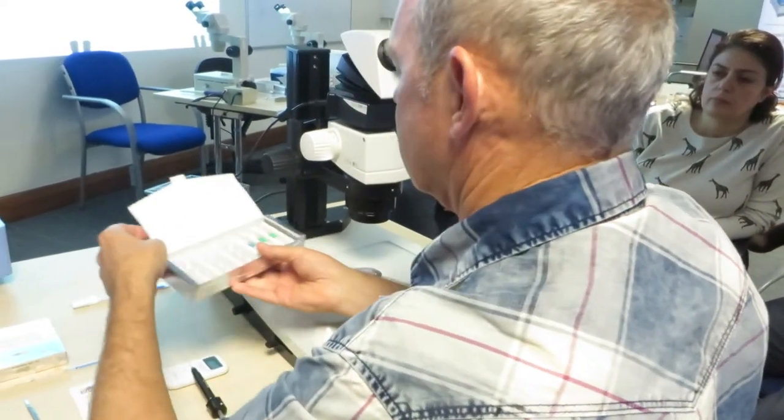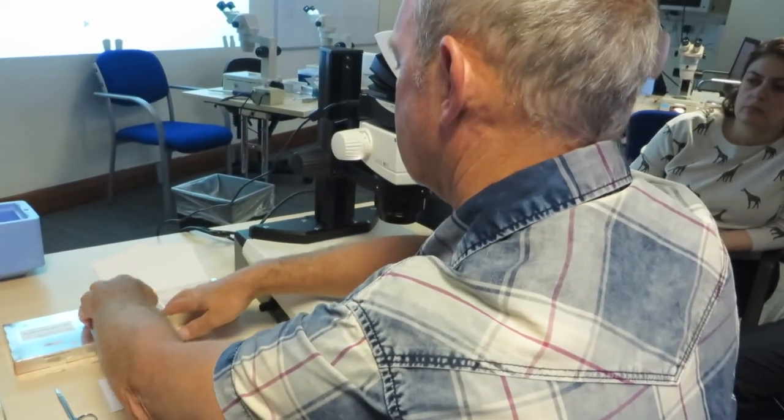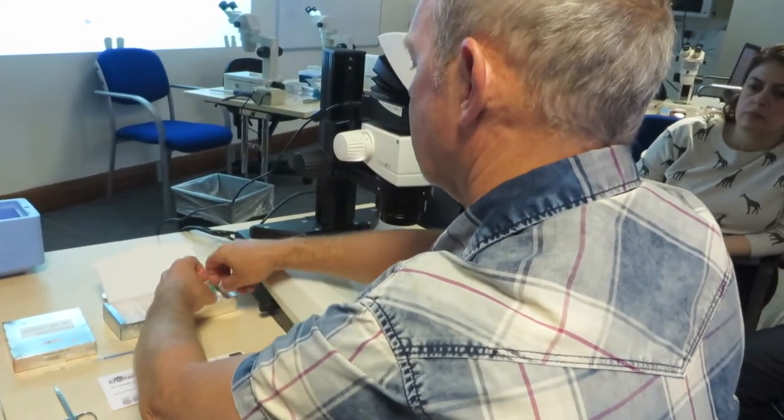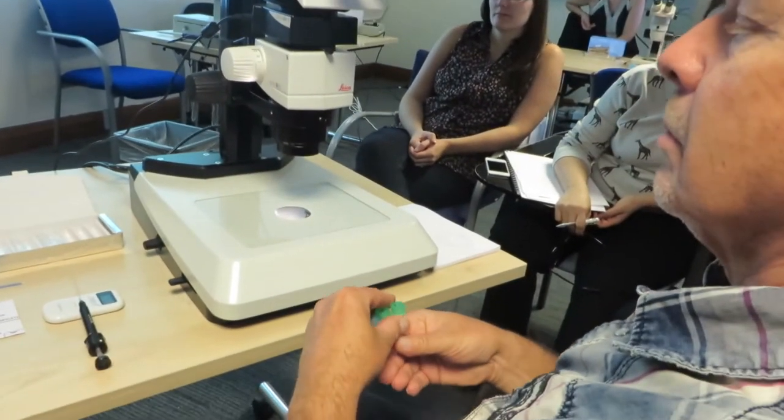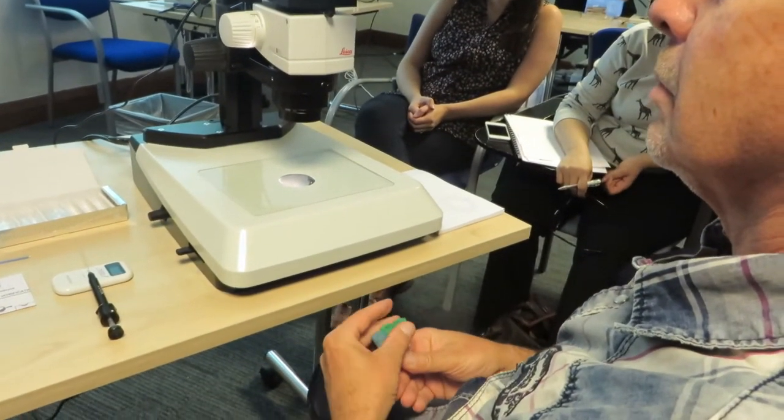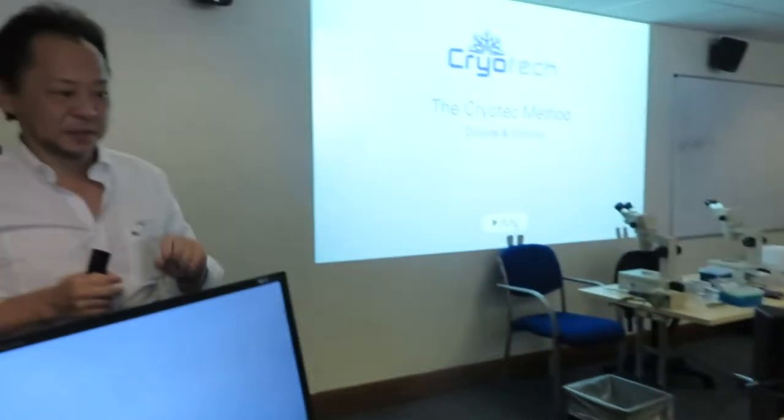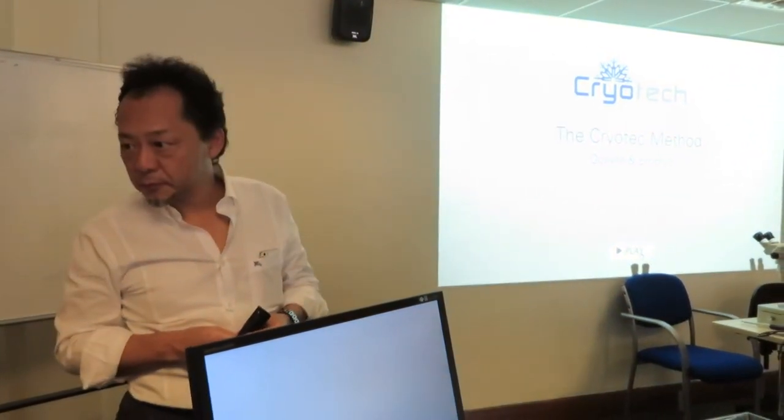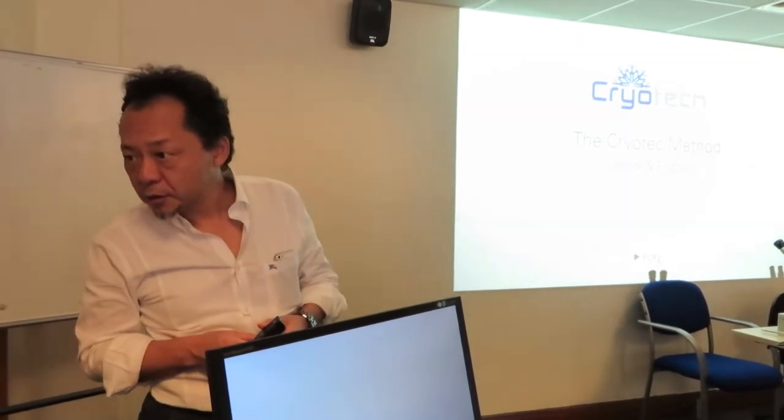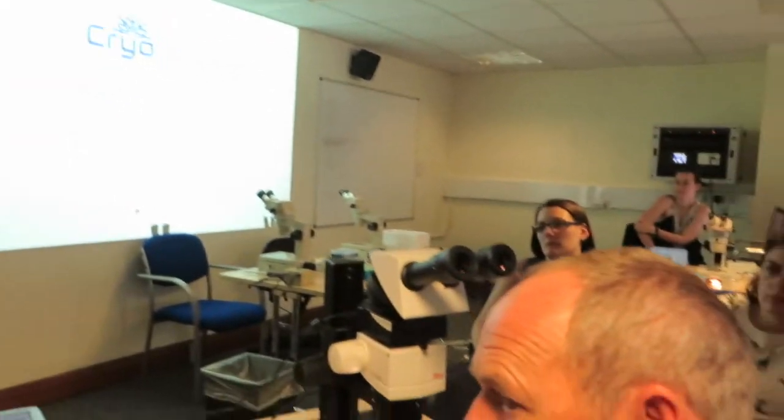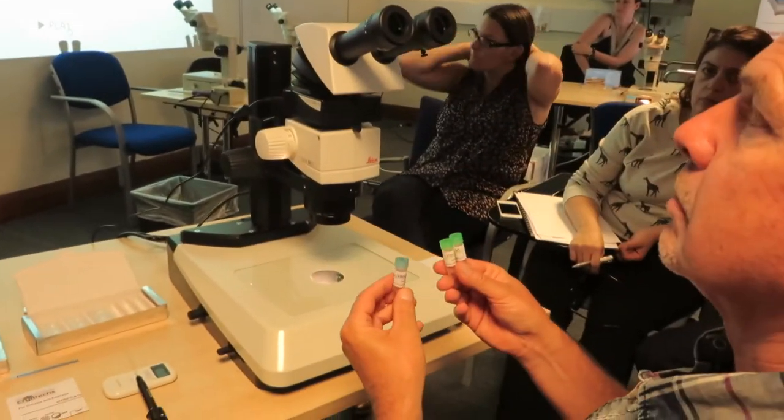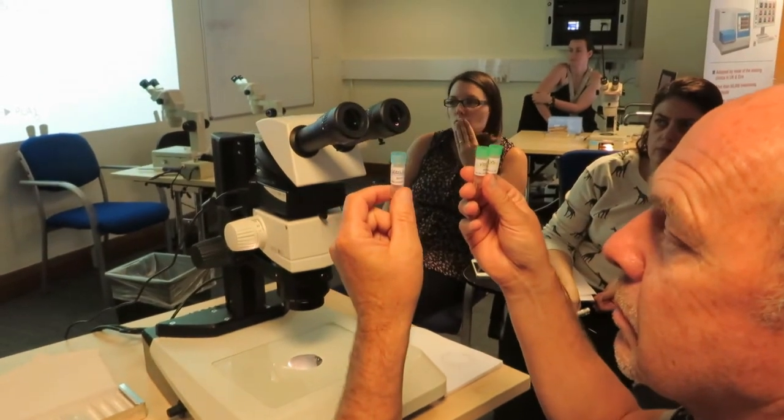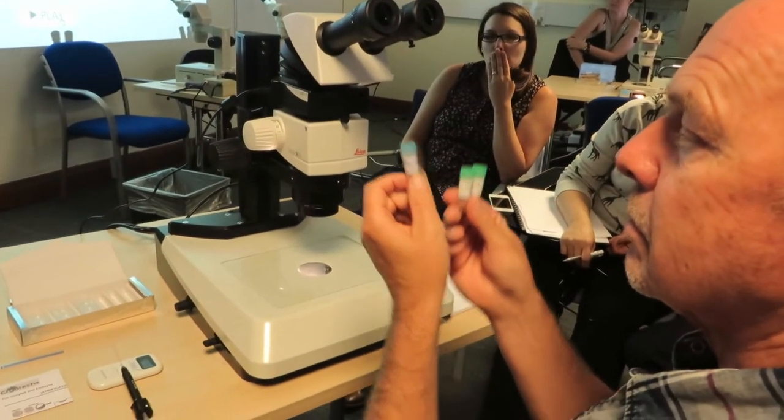Please take the vials out. The vials first? Yes. We take this kit out of the fridge more than one hour before use to make it room temperature. One hour? More than one hour. After preparing the dish, you keep it at room temperature, out of the fridge, more than one hour before for temperature equilibration.